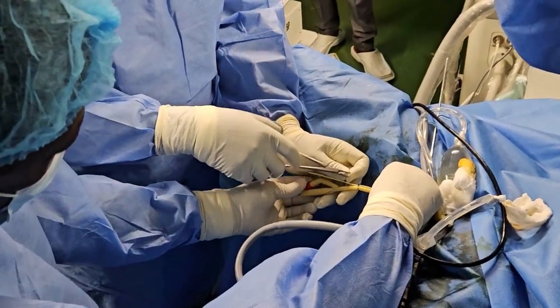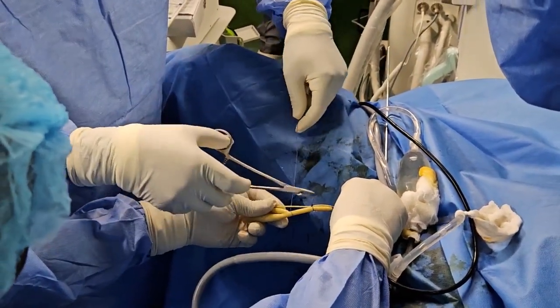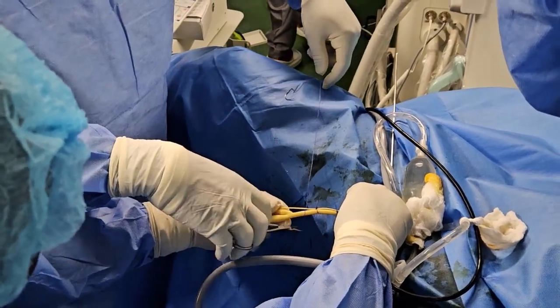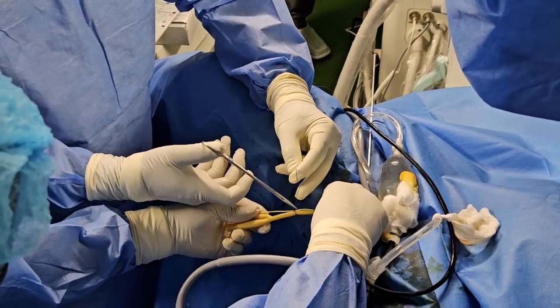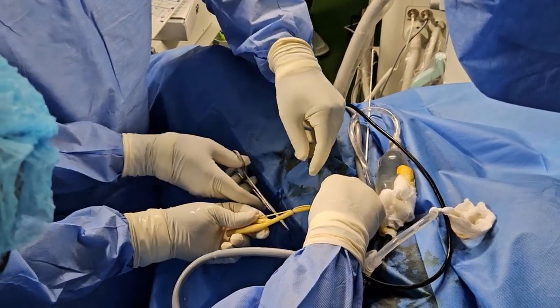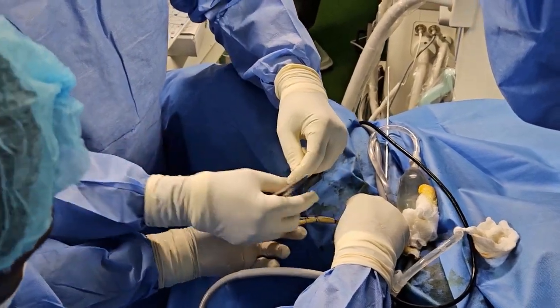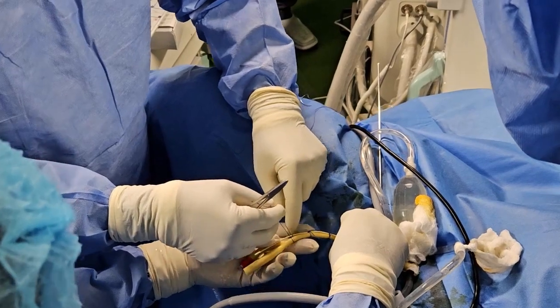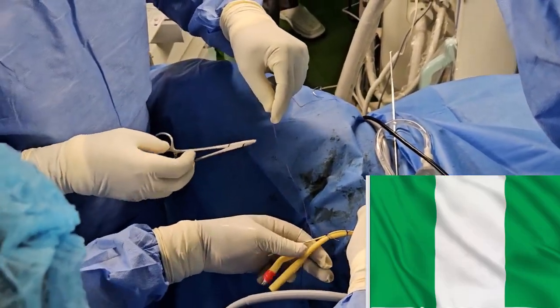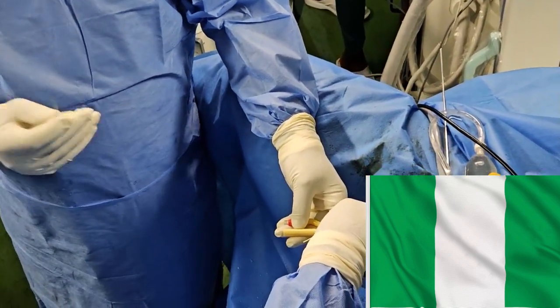And the explanation Alabi has given is that the collecting system starts filling from up when you inject your contrast. It prefers to fill from up, so he puts it to the upper pole. Are there other locations? That's the usual. You can go to the other side of the patient, just the side of the patient's neck.